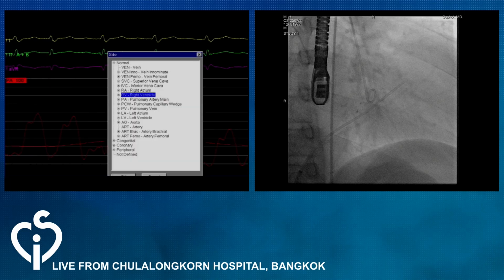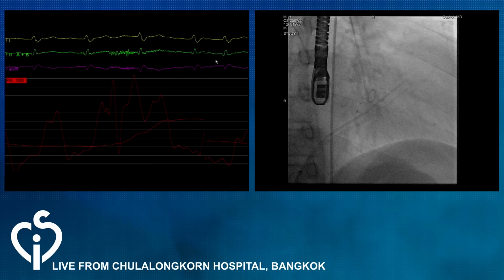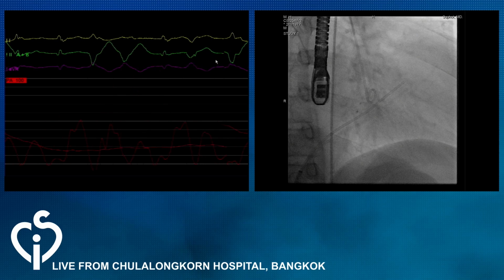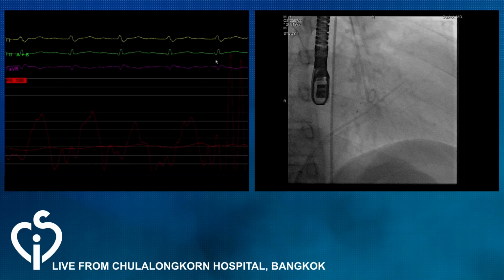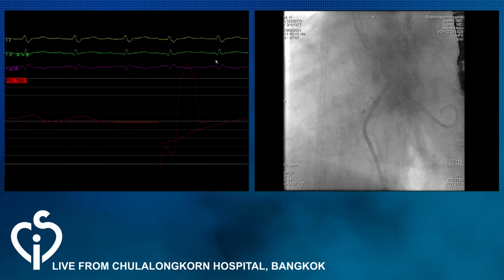It's slightly longish looking, isn't it? It looks like first degree AV block. Do you see the P wave, not very clear? I think it's there, but it may be better at a faster recording speed. The pre-procedure EKG suggests first degree heart block.